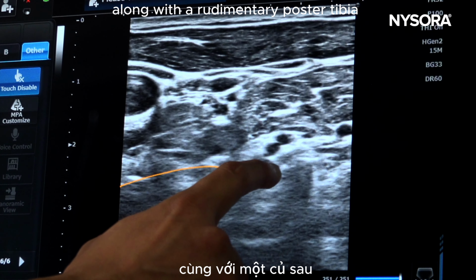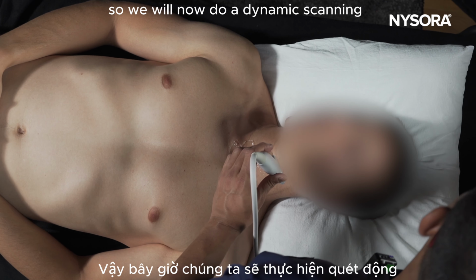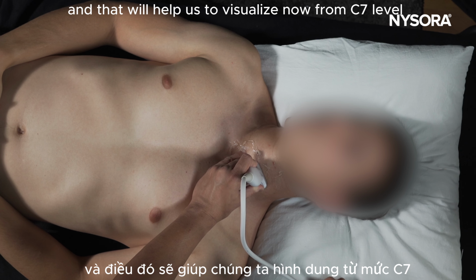Let me freeze the image and I'll try to show you the rudimentary posterior tubercle. So here in this image, you can see a straight line along with a rudimentary posterior tubercle. I call this the lounge chair position. The difference between C7 and C6: C6 has an anterior and posterior tubercle. So we will now do a dynamic scanning, and that will help us to visualize.